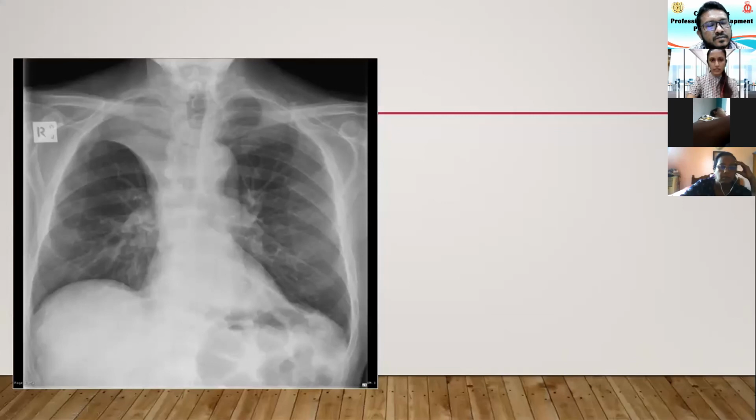In lateral views, is there anything like left lateral and right lateral to differentiate right and left lungs? Yes. When you do a right or left lateral, the pathology that you are thinking of has to be closest to the X-ray image. So if you have a pathology on the left side, you do a left lateral. If you have a right-sided pathology, you do a right lateral, because you need the pathology closest to the X-ray plate, so that the visualization is clearer than the other side.